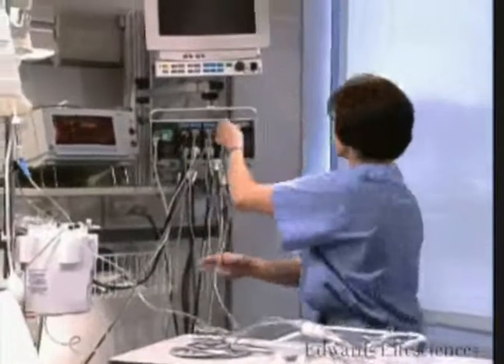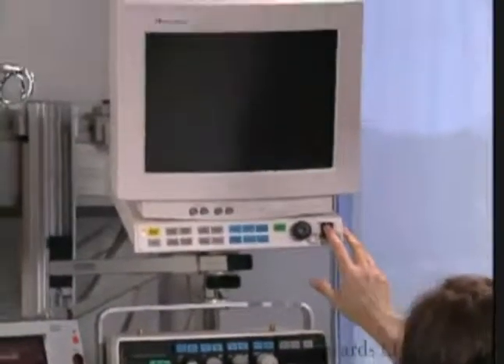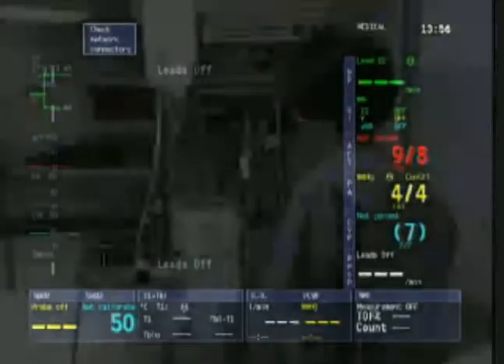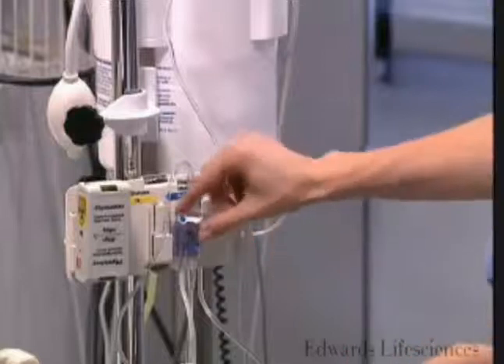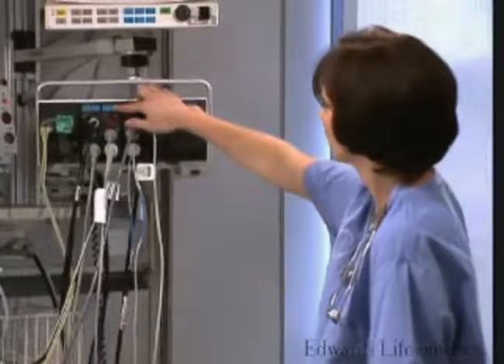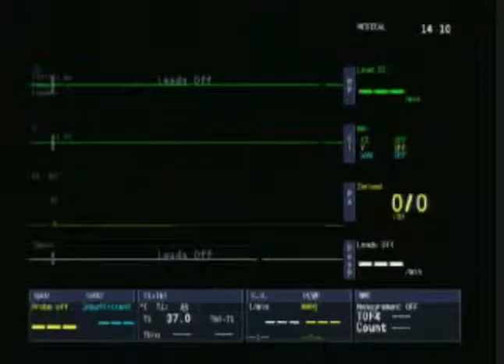Before patient monitoring is initiated, the disposable pressure transducer and monitor cable are connected. The transducer and monitor must warm up prior to connecting the system to the patient. The pressure transducer must be zeroed and leveled. As both zeroing and leveling procedures are usually performed at the same time, they are often thought of as one function. However, they are separate functions and serve separate purposes.